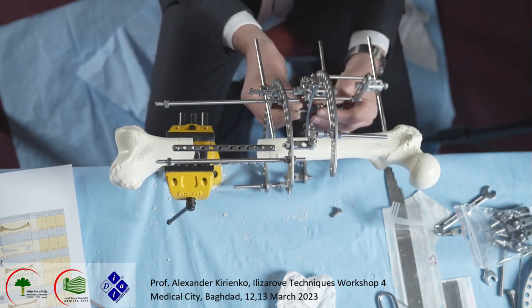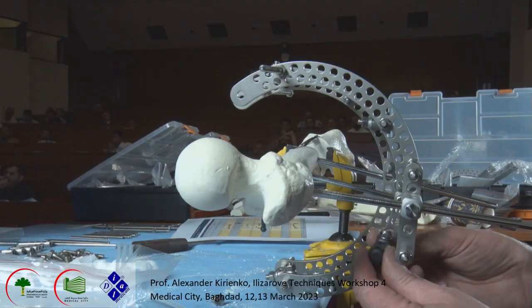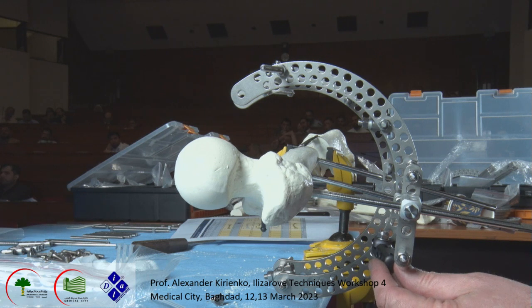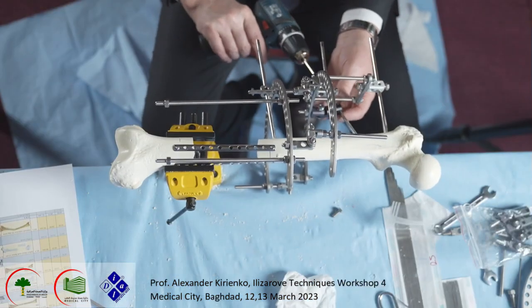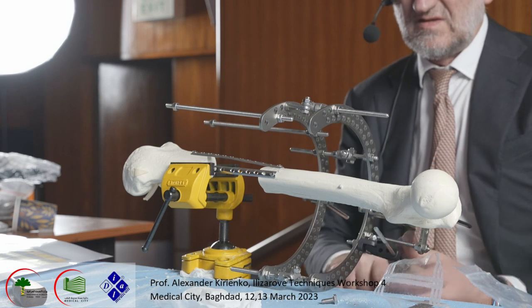Okay. We use this. I hope you see it. Yeah. Loosen a little bit more.